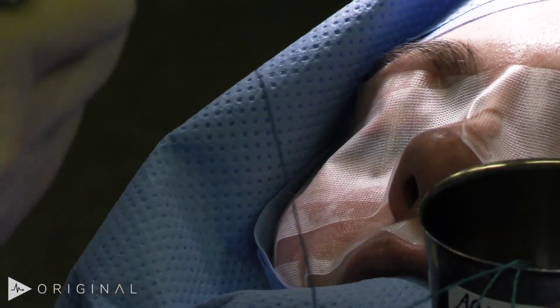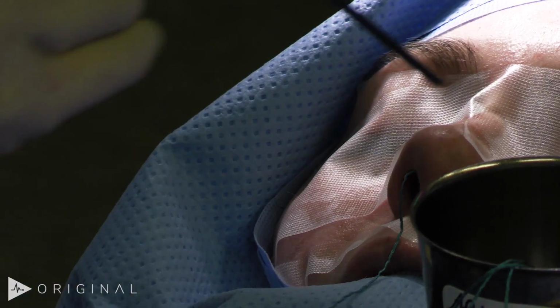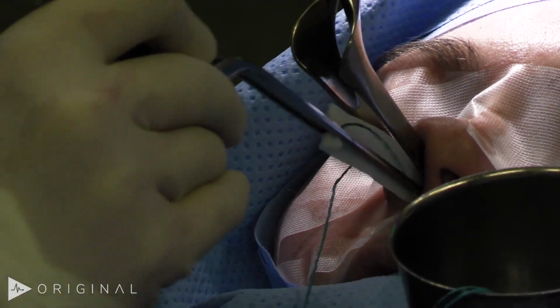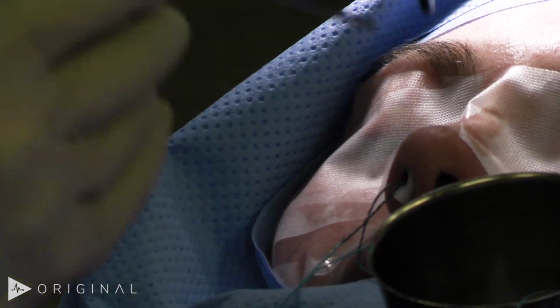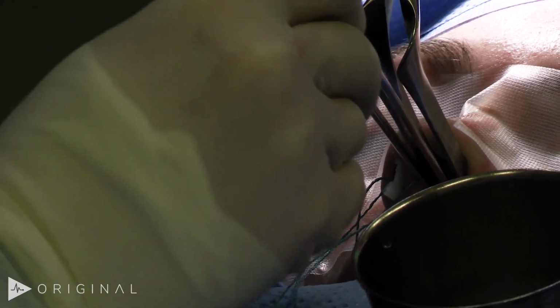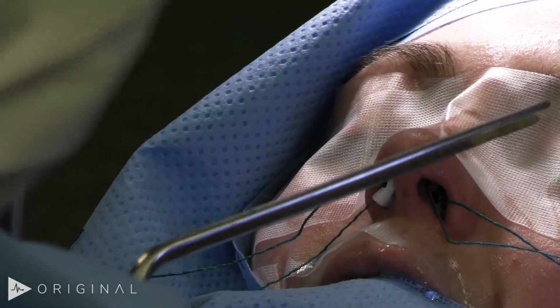So I'm just inserting Afrin-soaked pledgets in the nose. It's just going to help with decongestion. I use a nasal speculum and a bayonet to just line them along the inside of the nasal cavity. I usually try to get 2 on each side. In terms of positioning of the bed, usually try to keep the patient a little bit of reverse Trendelenburg, and then also you want the patient's head to be at a comfortable height with your arms slightly bent. And then the monitor, you want to be about eye level height. Okay, and then we just let those sit for a few minutes just to allow time for decongestion.